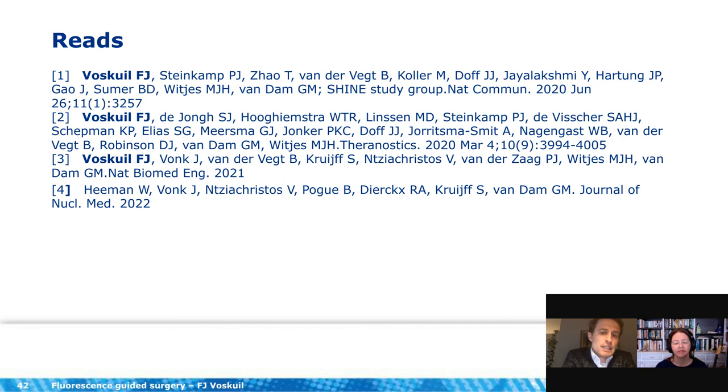So it was ex vivo, because I believe that for a TBR calculation, a selection of the ROI in vivo, of which you don't have any histology, isn't that reliable. It's nice to look, but to prove that you have a solid TBR and that the fluorescence is only taken up in the tumor and not in the surrounding tissue, you need to have histology data. That's only available ex vivo. So we first asked the pathologist to delineate on the H&E section, and then we looked back on our fluorescence imaging. I hope that answers your question, Lucas.